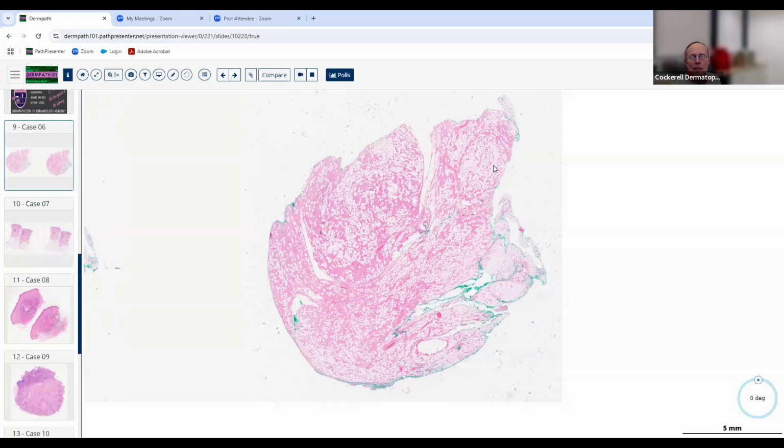And you see all these lipocytes in here. So if you get a benign neoplasm of fat, the diagnosis is a lipoma. Okay, so you've already made the diagnosis. You know it's a lipoma. So you're in the family of lipomas. Basically, it's like if you're clicking on your computer, you go to the drop-down menu and say, okay, what are some of the types of lipomas that we have to worry about here?